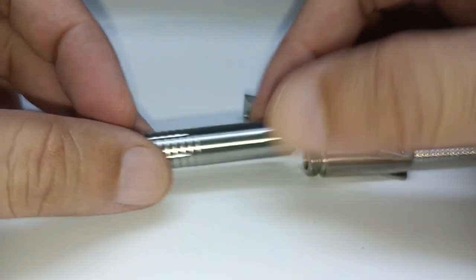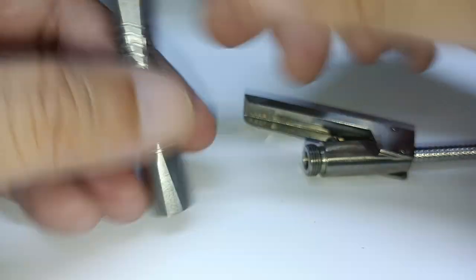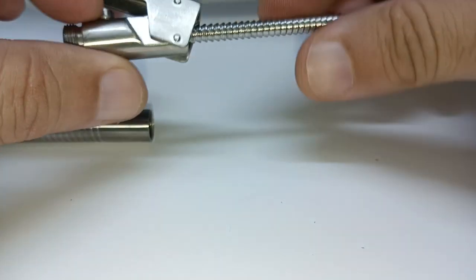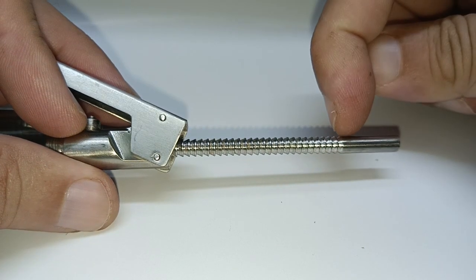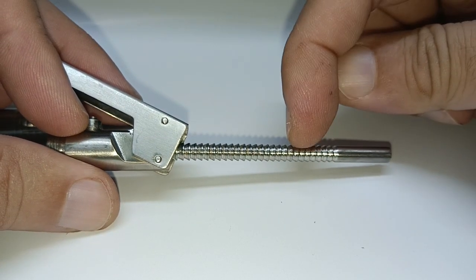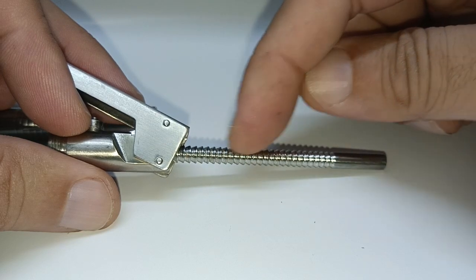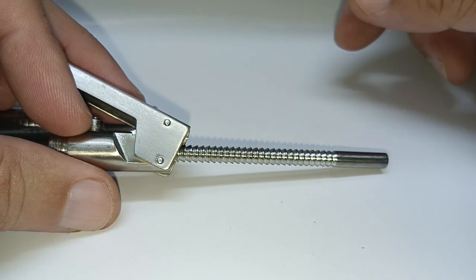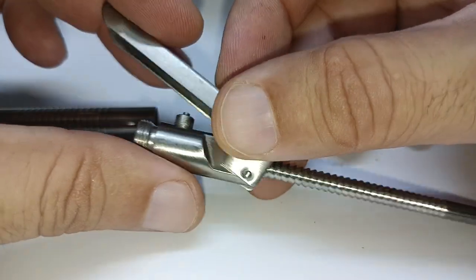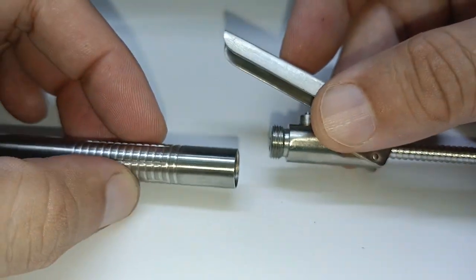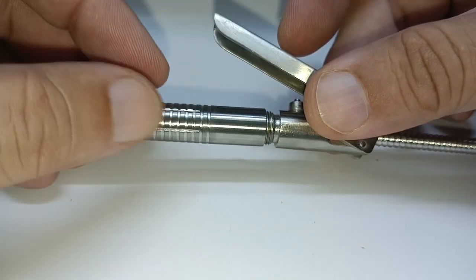But if you take a look at this whole scenario, you have a lot of clicks available. So if you use one, two, three, four, five, six, you should be able to numb this tooth again and again. You would not need to deliver the whole carpule to the patient. Very little amount is needed at one time, and you should be able to get immediate anesthesia.